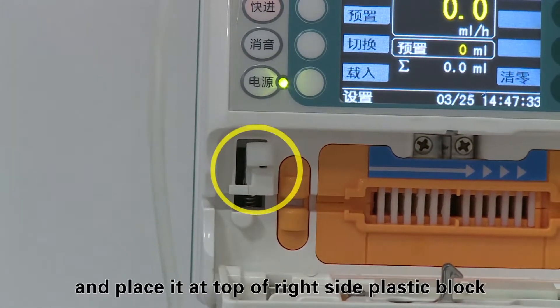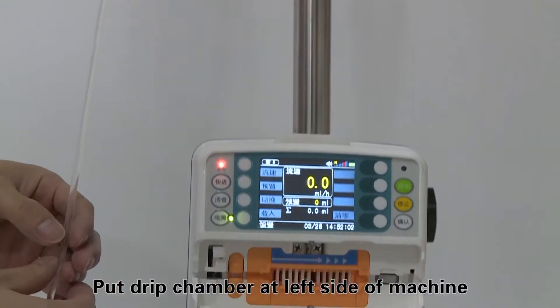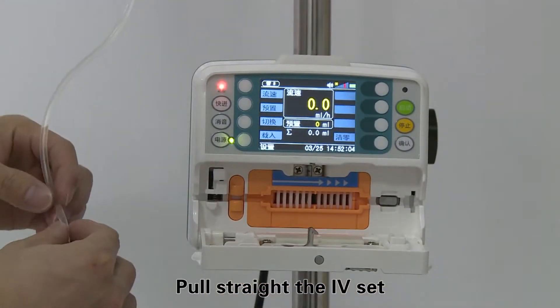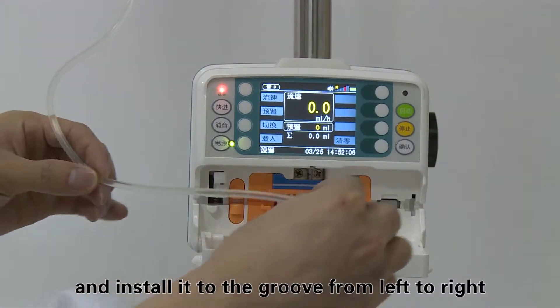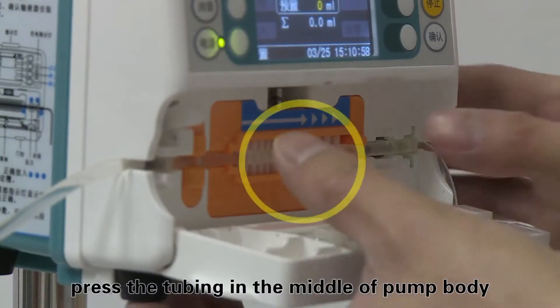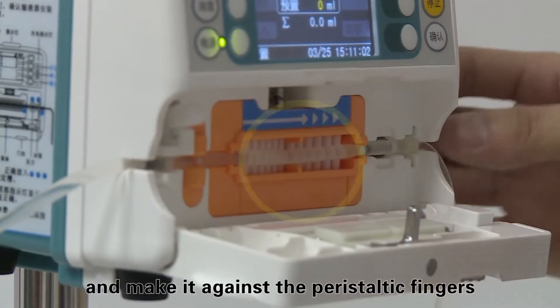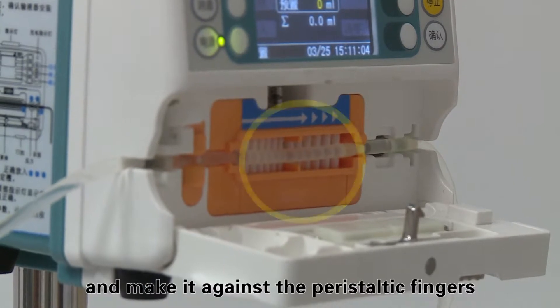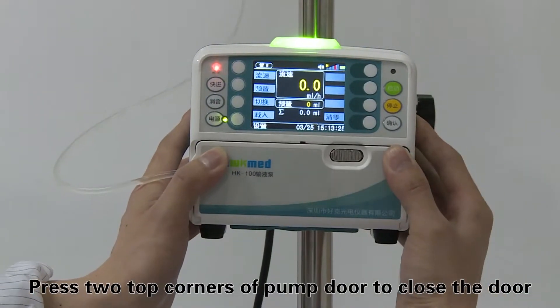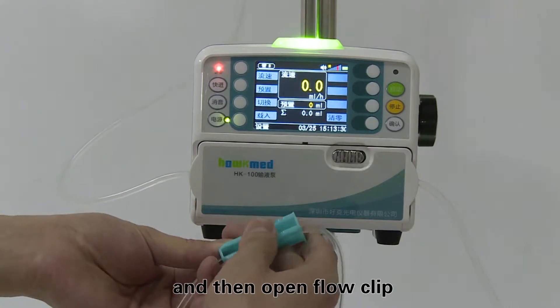Put the drip chamber at the left side of the machine. Pull the IV set straight and install it into the groove from left to right. Press the tubing in the middle of the pump body and make it against the peristaltic fingers. Press the two top corners of the pump door to close the door, then open the flow clip.